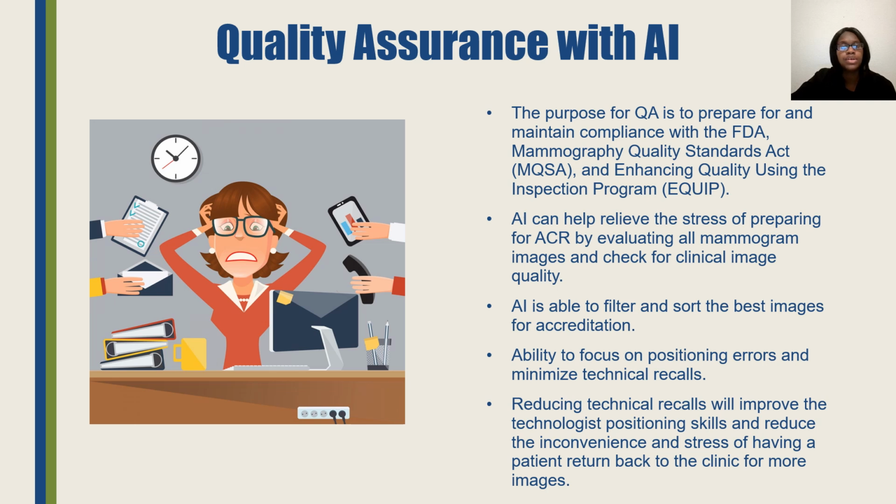Okay, you have your quality assurance with AI, which is going to help take away some of that stress, especially at that time of the year when you have to do different quality control tests, or if you have different inspections. It can help focus on your position errors and minimize technical recalls. It's good at flagging what needs improvement and what does not.